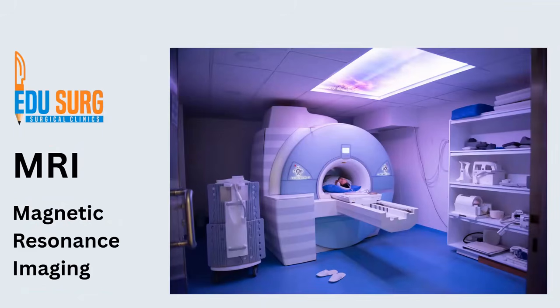So I hope that with this series of videos as well as the MRCP video that we already have, and we have a video on MRI rectum by Dr. Amar, who's a radiologist, all these MRI videos, when you see them together, you will come to learn how to see MRI and how to identify pathologies. We are also going to come up with an MR fistulogram, so that is something to look forward to. And with all these, some cases of MRI, maybe liver, you can see in the upcoming series, and that is how you will learn how to identify pathologies and the various series in MRI.